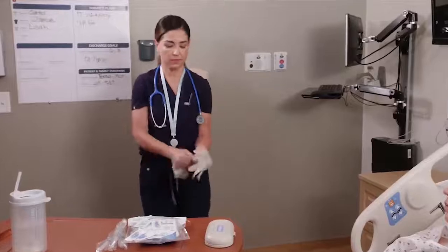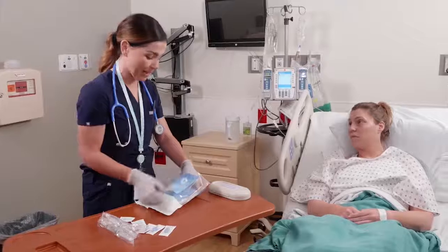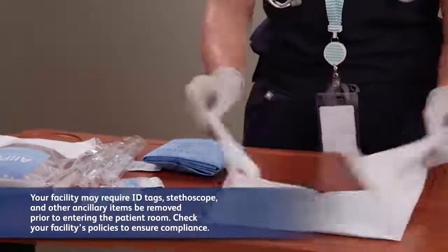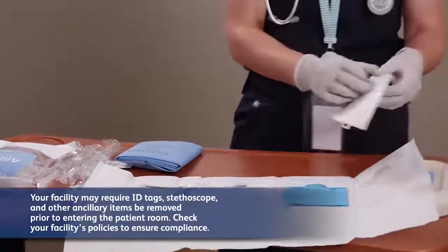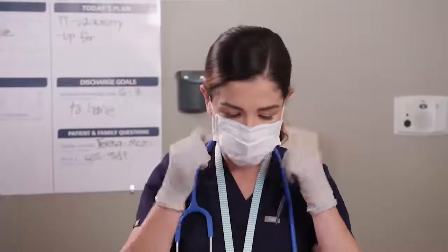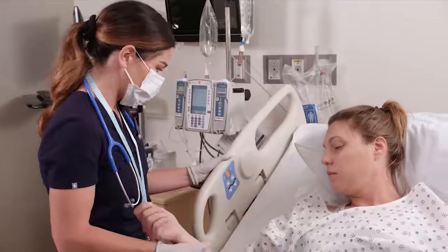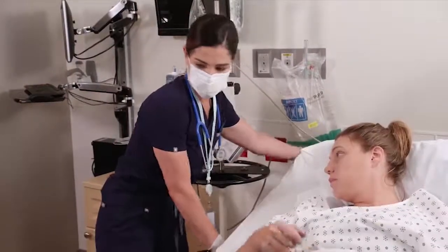Next, don non-sterile gloves. Begin to assemble supplies. Take care to maintain sterility of supplies when opening packages. For infection prevention, be sure to wear a mask. Position patient to allow adequate visualization and access to the insertion site. Review dressing label for date.